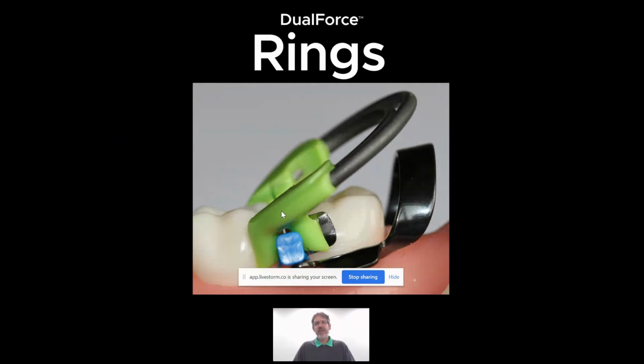So if you're not familiar with the ring, if you haven't used it, the first time you use it, you might say, oh, I don't feel that this ring is seated properly. What we always recommend you do, once you have seated the ring, is take both your thumbs and press down on the resin part only of the ring to make sure that the ring is fully seated.